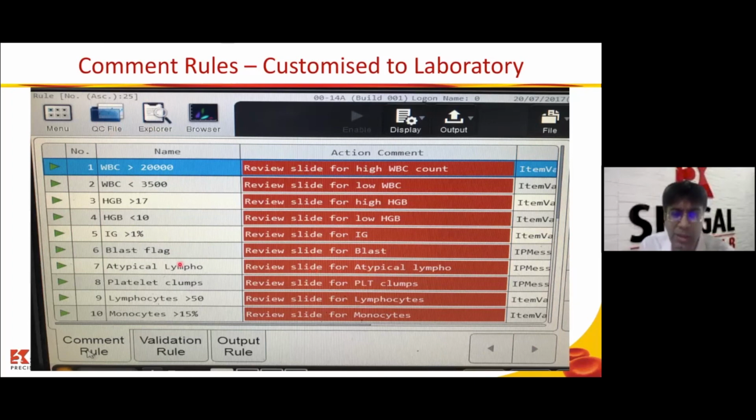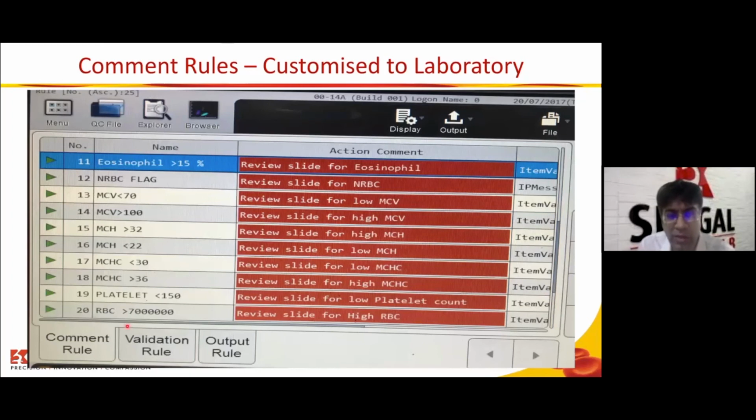We are telling them the machine is flagging for atypical lympho, and this is why we are reviewing the slide. So this is the actual flag which comes in my analyzer. So we have given an RBC count of more than 7 million. This is a lab customized rule. MCHC more than 36, review slide for a high MCHC.